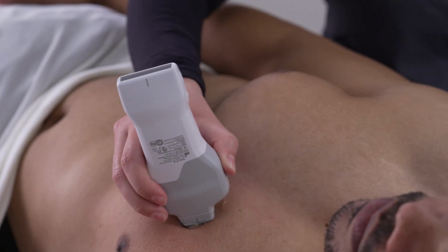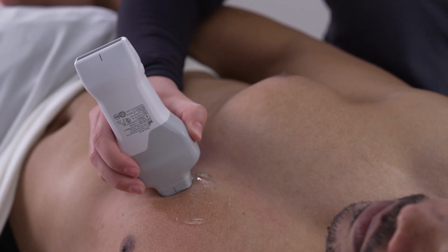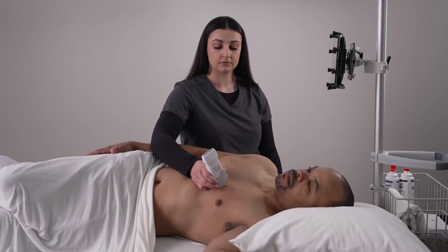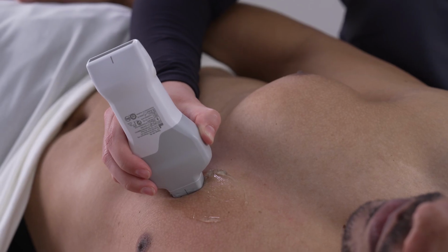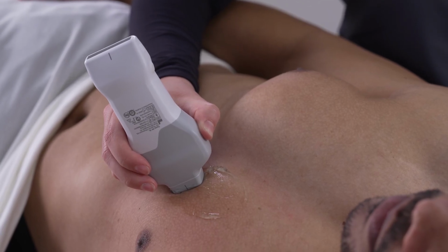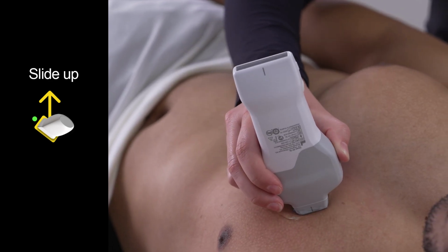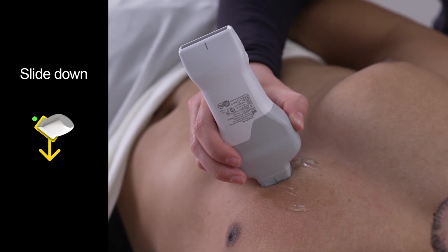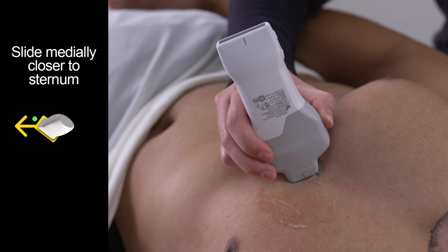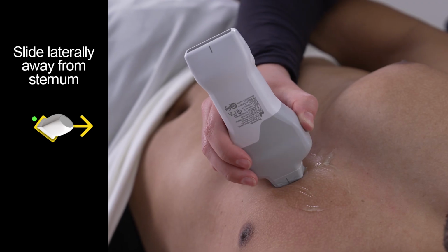Sliding is the movement you will likely perform at the beginning of every scan, making large, slow circular sweeps until moving anatomy appears. It is the only movement performed without your wrist stabilized. For all other movements, you want your wrist secure against the patient to prevent any accidental probe movement or slipping. Sliding guidance is also used for smaller movements, such as sliding up towards the patient's head, sliding down towards the patient's feet, sliding medial towards the patient's midline or sternum, and sliding lateral towards the patient's left side.